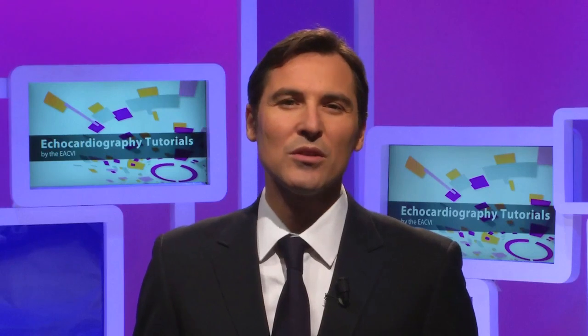Nuno Cardim will show how to perform an echocardiographic examination in patients with cardiomyopathies. He will focus on the most typical features that need to be examined to make the appropriate diagnosis.